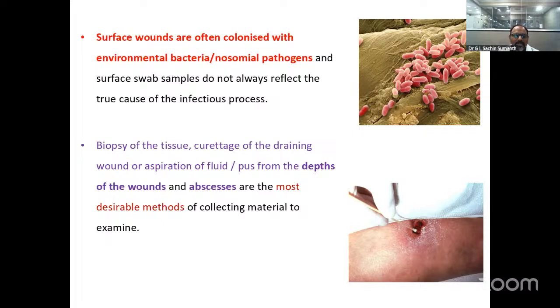Definitely, because on the surface, suppose the swab was taken just touching the surface of the wound, and that is already contaminated or colonized with environmental bacteria and nosocomial pathogens, definitely it will give erroneous reports. So many times we see this kind of result coming, and we go to the wards and see how the patient is doing, because we got all the antibiotic resistance to a particular pathogen that is isolated from a blood, from a first culture.